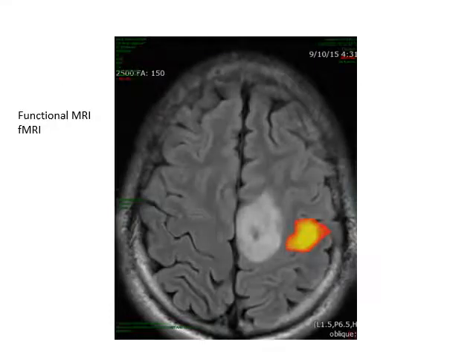All right, so here's a little picture of a functional MRI. We've got a brain tumor here. They were just trying to figure out what to do with this person. So they had the person move their hand, and this is where hand movement was. So they knew if they took this out, it was a benign tumor. They just want to make sure that they know exactly where hand movements are. So when they're doing the surgery, they're super, super careful not to touch any of this spot at all so they don't injure any of the hand movement. So that's the functional MRI.